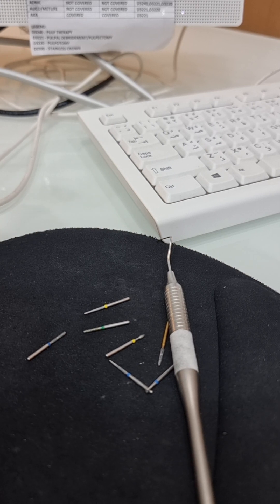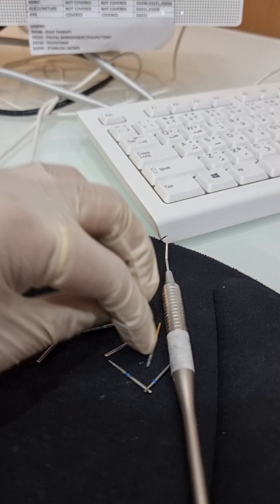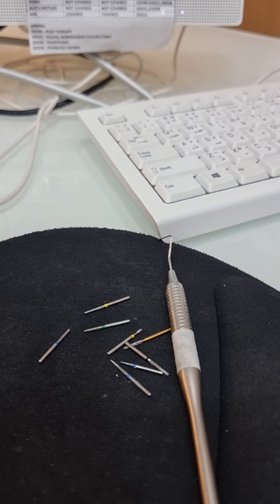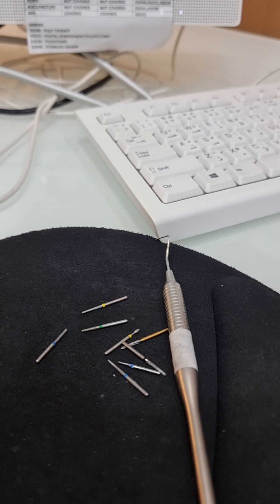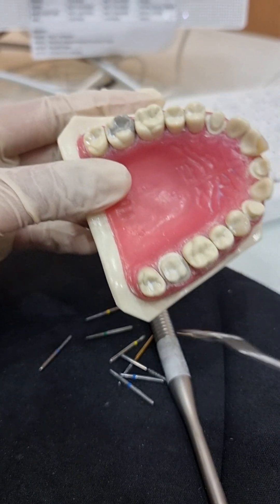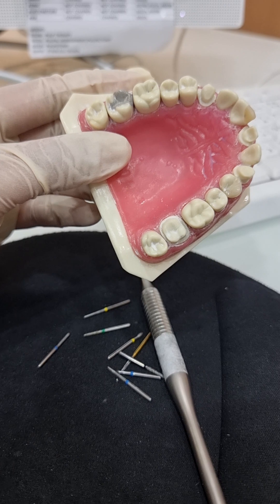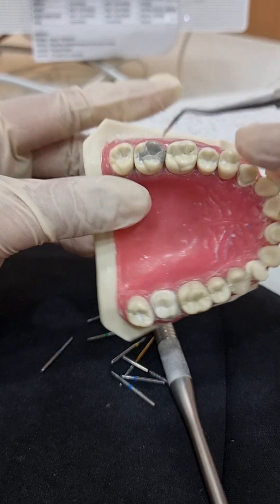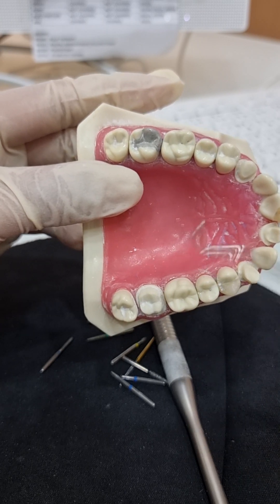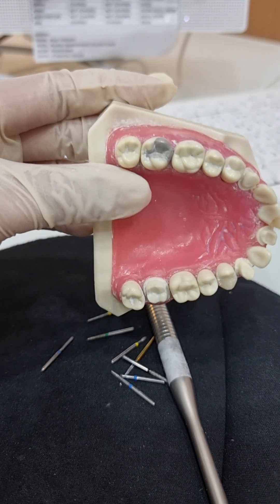For amalgam, you don't need a burr - what you need are instruments, because it will already be machine cut. After machine cutting, you'll have to put the grooves in, and for that you can use either a straight burr or a round burr. You would also need a condenser and a Tofflemire retainer. The ADC has given you a list of all the instruments they will provide in the exam, so you might as well practice with the same set. You'll also need a burnisher.